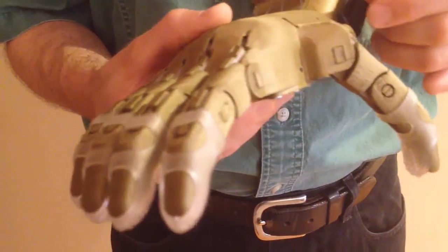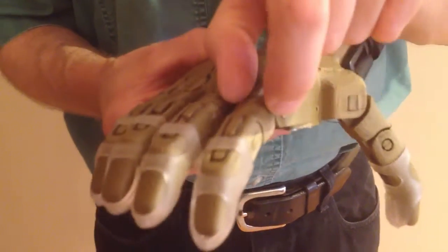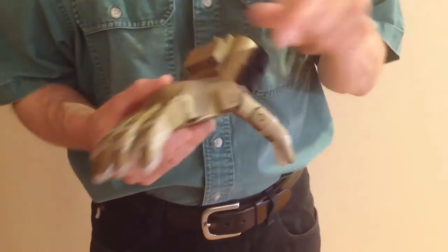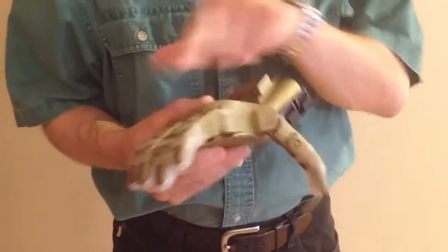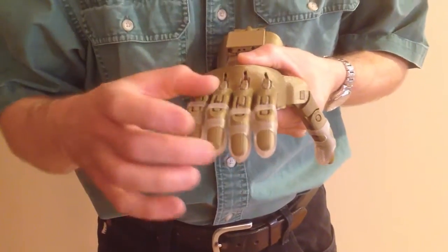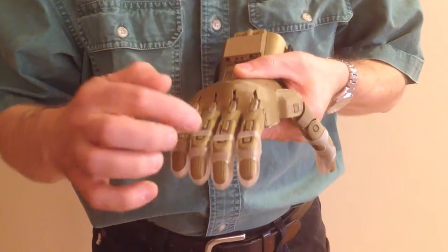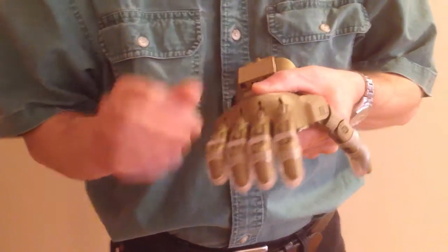I have seen occasions where the thumb proximal has been intermixed with the fingers, so you've got to have the right component on the right digit. You've also got to watch that the thumb tip hasn't accidentally been used on a finger and vice versa. These fingers actually have two different lengths of fingertip — the pinky finger and the index finger use a short fingertip, and the ring finger and the middle finger use a long fingertip. Make sure the right fingertips have been put on the right fingers.